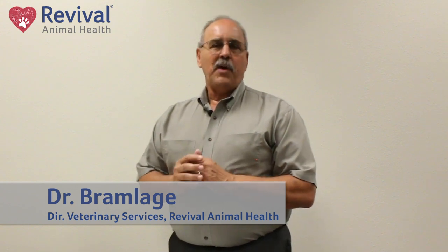Hi, I'm Dr. B, and today we're going to show you how to safely and effectively give an injectable vaccine to your pet.